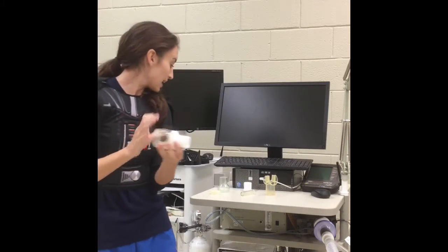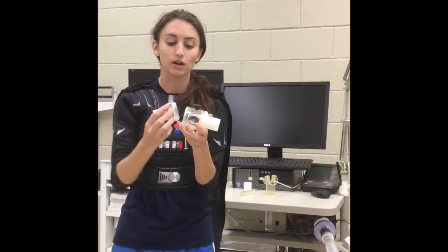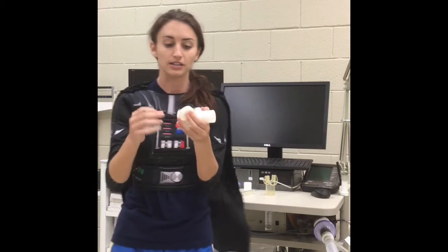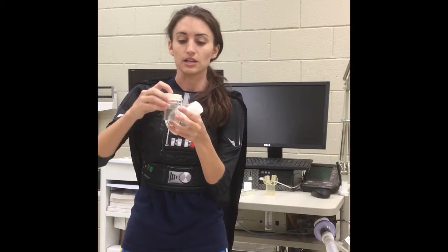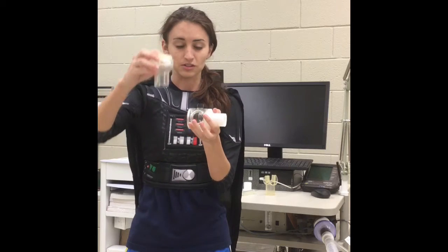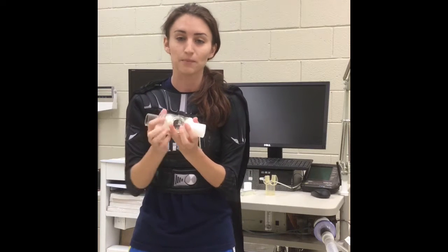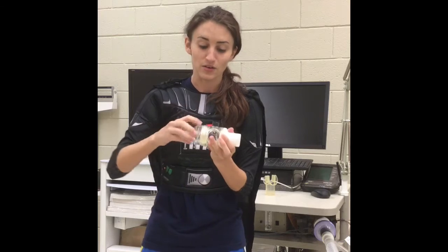Then we will take a second clear piece to make sure the air will flow out as well. We will take another diaphragm and place it in the clear piece with it going out, and screw this on — again, tight, but not too tight to where you cannot unscrew it.